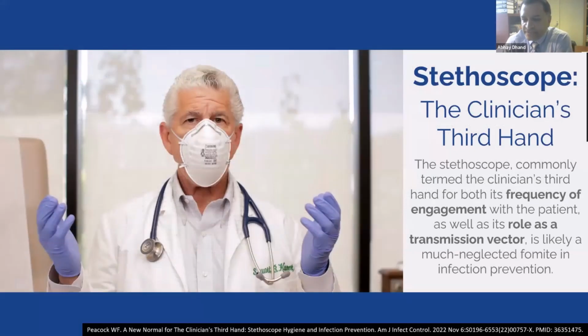So what we see in this picture is a physician, and the troubling thing is that the physician is well protected with the mask, the hands are very well protected with the gloves, but one thing that is not protected is the stethoscope. The stethoscope is something that we use in the daily care of the patient. It touches the patient, it touches the hospital surfaces, it touches the lab coat and all the things.